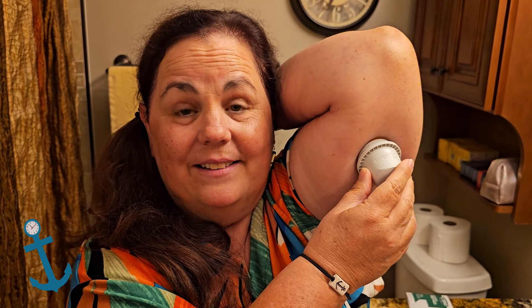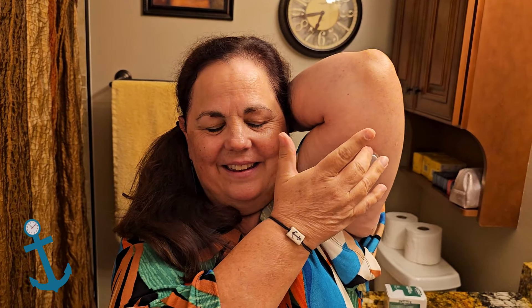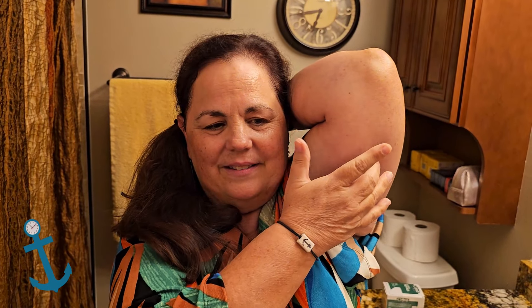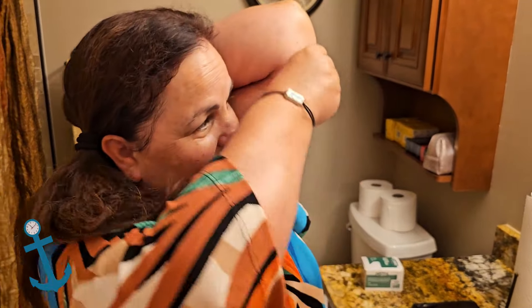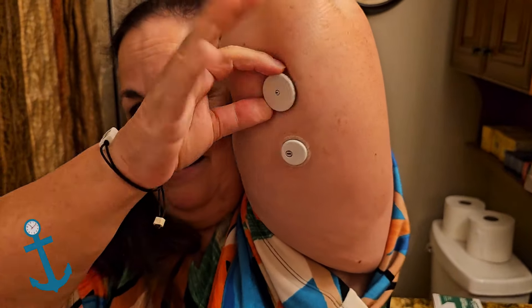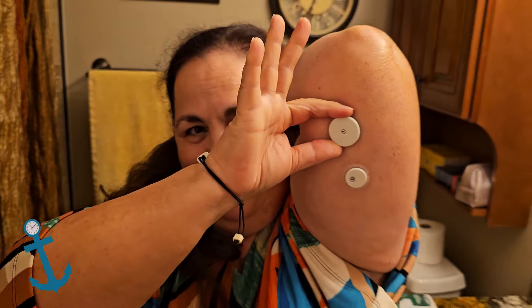Not too bad! Is it on there? Yes! Oh, look how little it is! I'm supposed to gently feel around the edges to make sure it's all attached — the adhesive — it's all attached. Oh my gosh, it's so tiny! Let's see the comparison. One looks like a nickel and one looks like a quarter. Wow, that is teeny tiny!